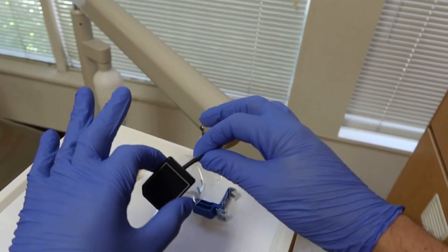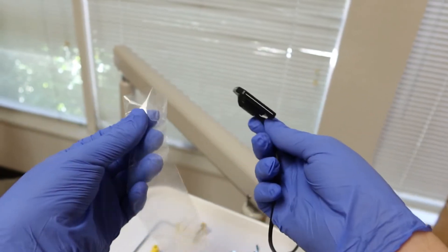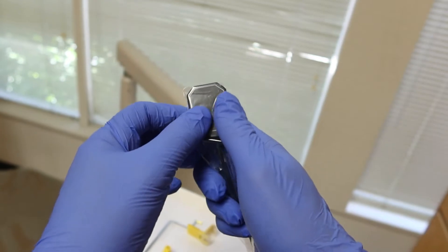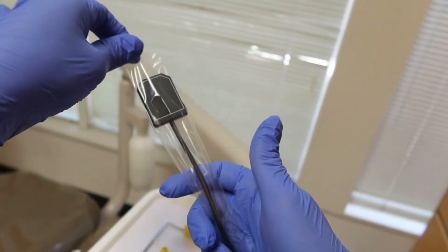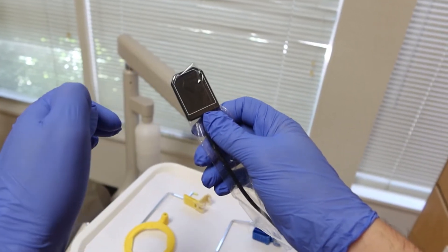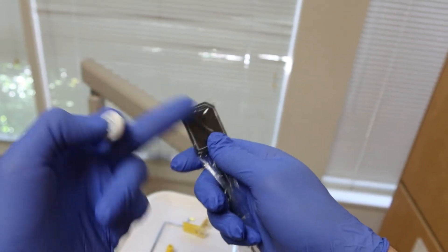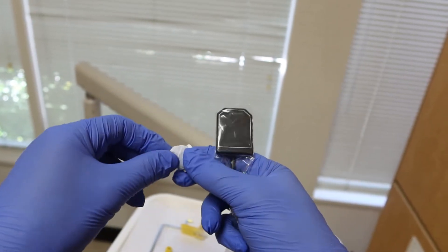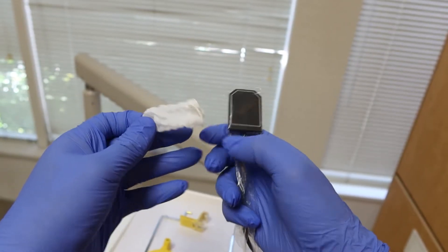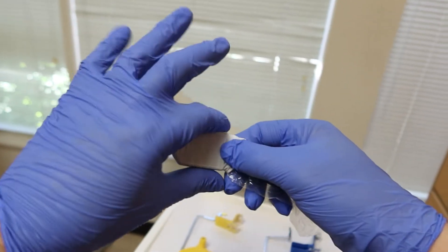Our sensor is looking nice and bare, but when we use it on the patient we need to put some protection on it. Depending on where you work, they might have anatomically correct protective sleeves that mold around the sensor really well. Some are nice and loose, so we add extra grip with a finger cot — just unravel it and slide it onto the sensor. Make sure it unravels completely for a nice snug fit.